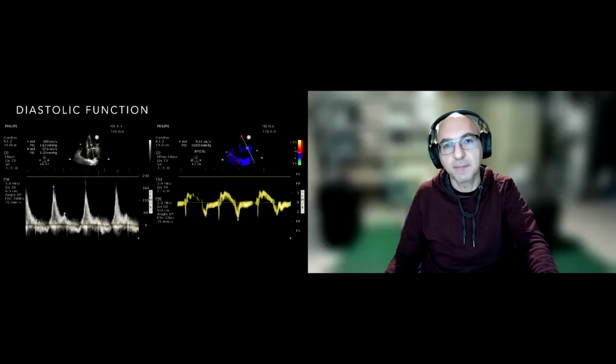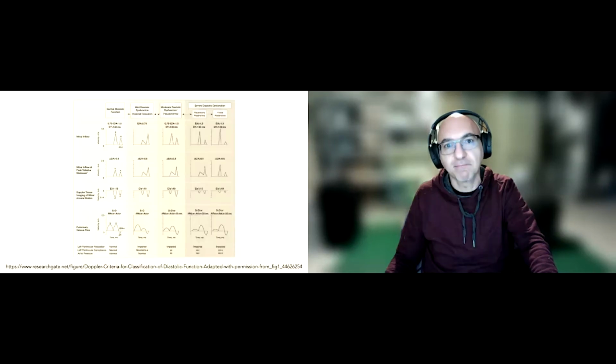All right, well, let's move on a little bit, because I know we have a little more to talk about in this realm. But one thing to add, for extra flavor: we measured the left atrial size, and in this patient, it was enlarged. For me, about 4 centimeters is considered about normal. When you get past 5 centimeters in this diameter, we're starting to get into the realm of abnormal. There are certainly more specific ways of measuring it, but as a rough number, about 4 to 5 centimeters is the upper limit of normal for LA size.